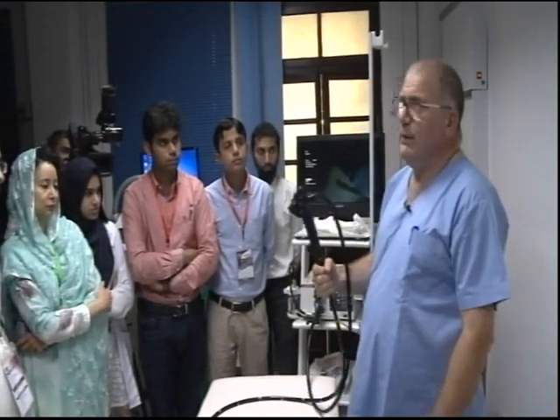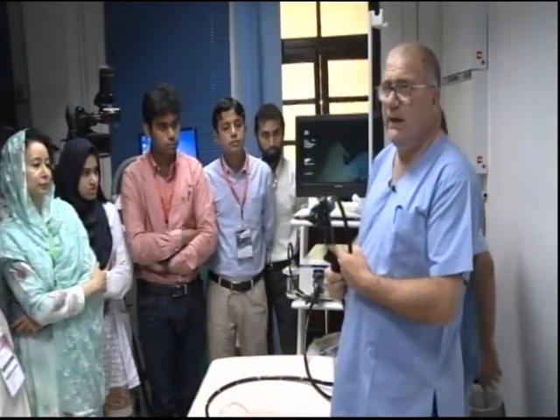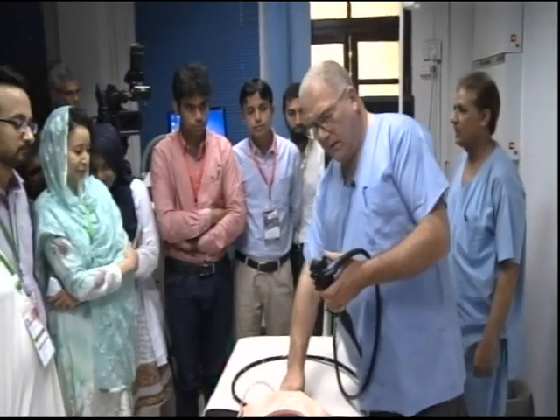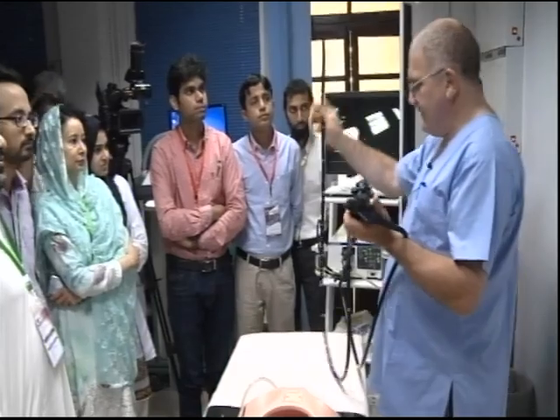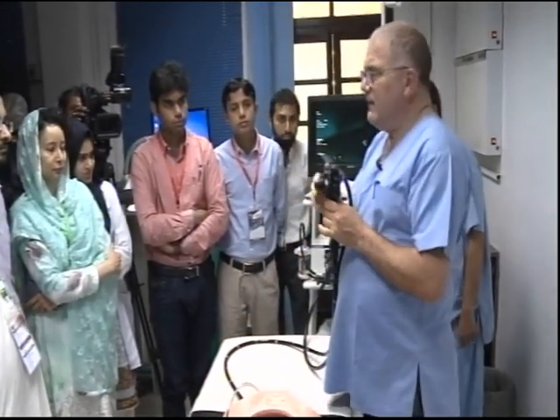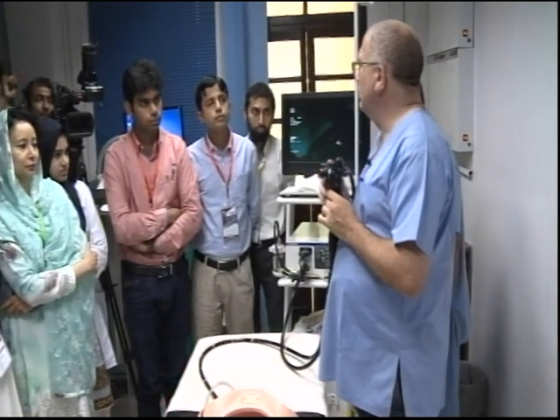Does everybody use Olympus scopes? Olympus? Everybody? Great. So when we've got the scope in our hands, let's look at this. What does the big wheel do?